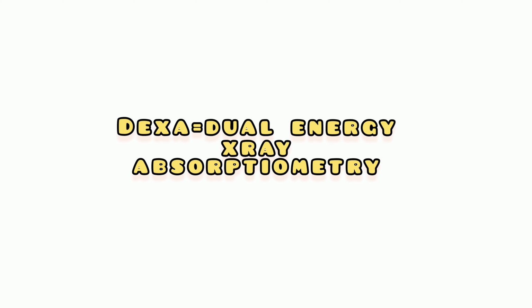After the bone mineral density test using DEXA scan was discovered, this became one of the gold standard tests for diagnosis of osteoporosis. Now let us understand what is a DEXA scan. DEXA stands for Dual Energy X-ray Absorptiometry. In simple words, it is an X-ray examination, a little bit more complicated than an X-ray, which helps us to determine the density of the bone of the patient.